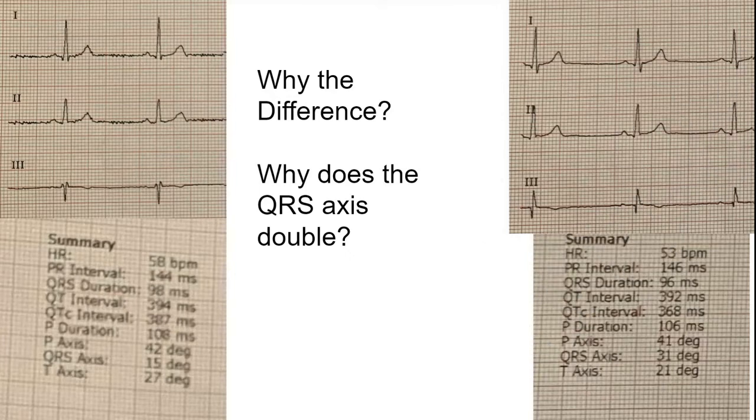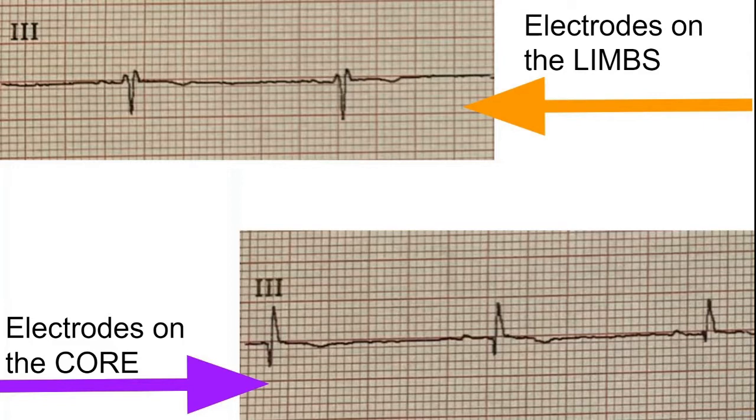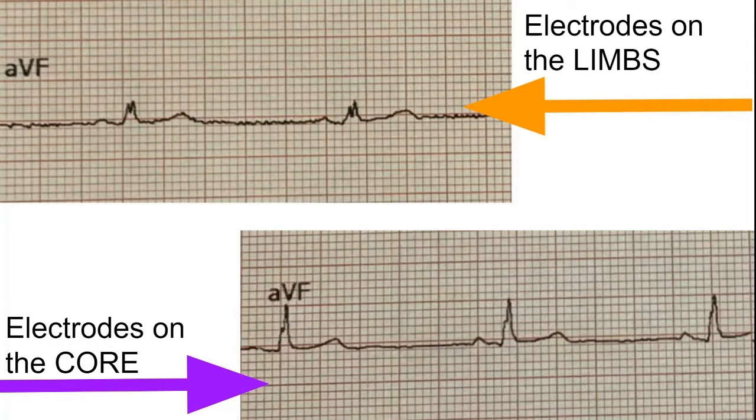What is the difference? The difference is proper placement versus placement of the limb leads on the core. The limb leads are named limb leads because they need to be on the limbs and not the core, and it does matter. It does make a difference and will change the way your 12 lead looks. So here, once again, the electrodes are on the wrists and the ankles versus the electrodes below the clavicles and on the sides of the abdomen. Likewise, again, with AVF.